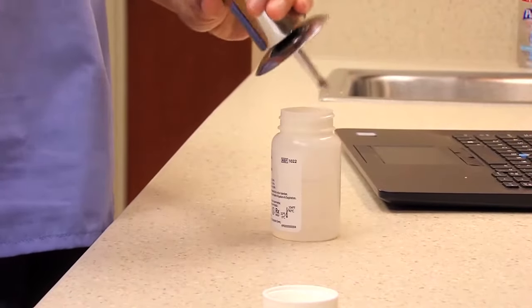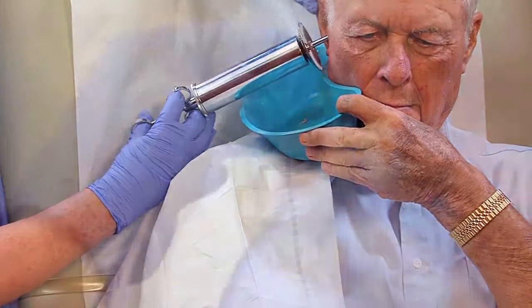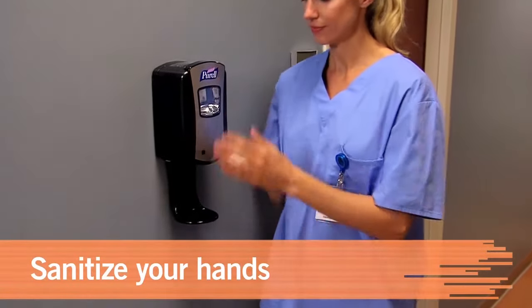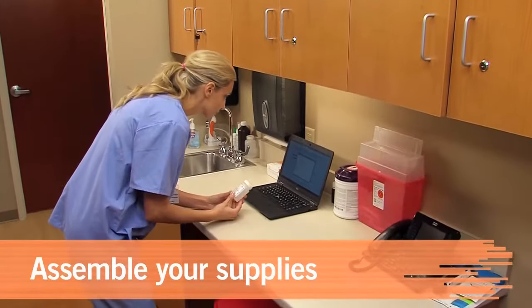In this procedure, you'll learn how to remove excess or impacted earwax called cerumen from one or both ears. The first step is to sanitize your hands. Next, check the provider's order and assemble your materials.